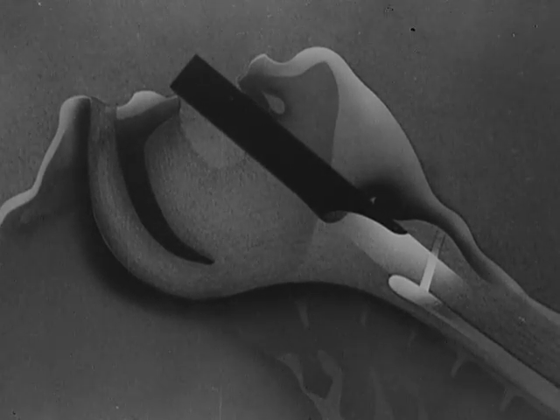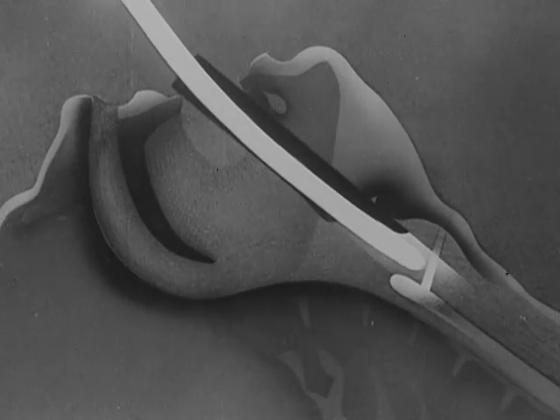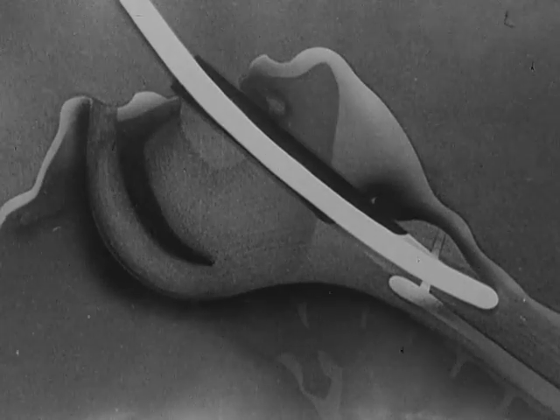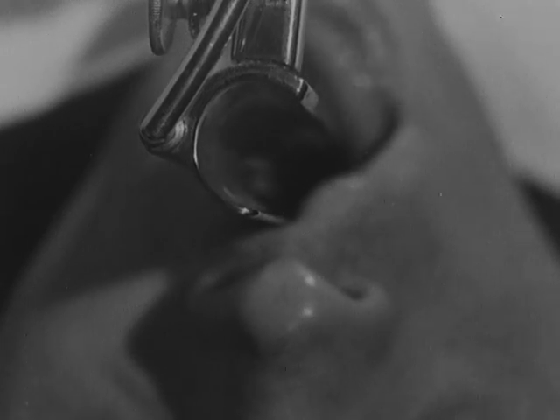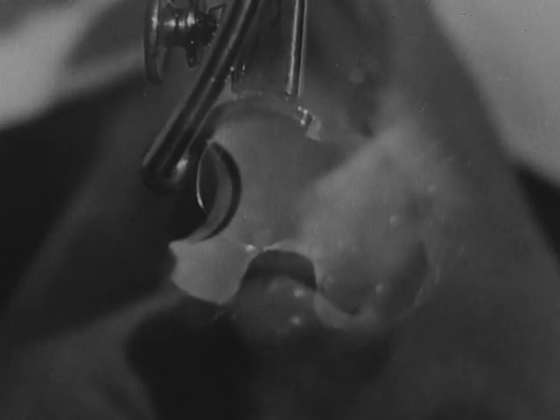So long as the glottis is open, the tube can be passed along the lumen of the laryngoscope into the larynx. The beginner will have to learn to recognize these landmarks as they appear to the anesthetist. We will now see what they look like through the laryngoscope. This is the uvula silhouetted against the wall of the pharynx. The bulb of the laryngoscope can be seen on the left. And here is a simplified drawing of this region.